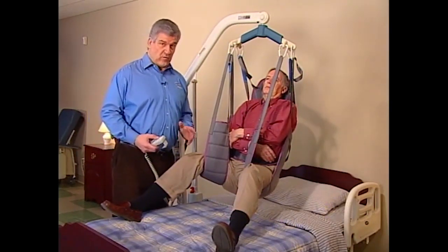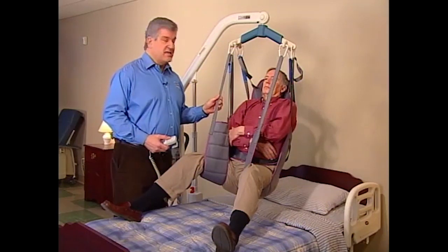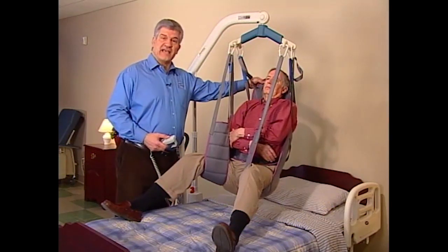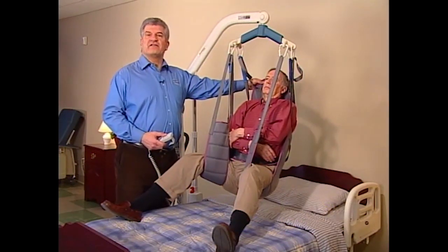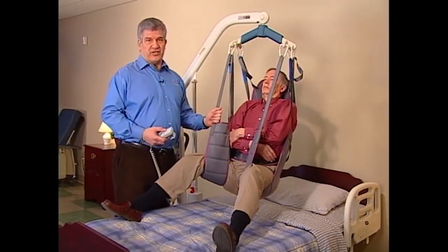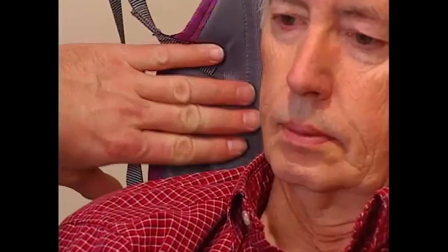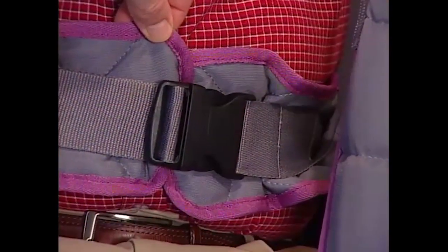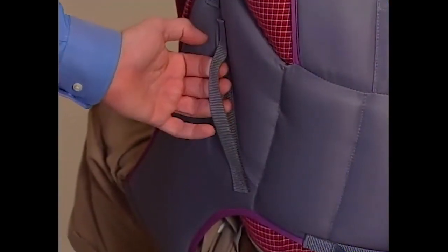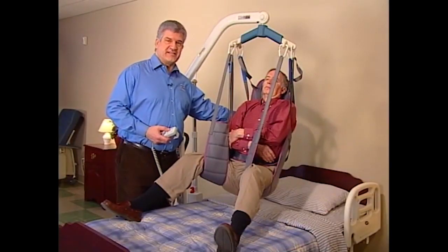Always check with a physician before selecting a sling. The Reliant toileting slings are designed for toileting residents who have full head and neck control. The Dress High toileting sling has a head support section. Both designs allow the caregiver access to the patient's clothing. They provide definite visual cues so that you're able to tell the inside from the outside of the sling. The inside is smooth and contains a waist belt, while the outside has sewn-on labeling information and a reinforced grab handle to assist the caregiver in positioning the resident. Make sure the handle is always away from the resident's body.